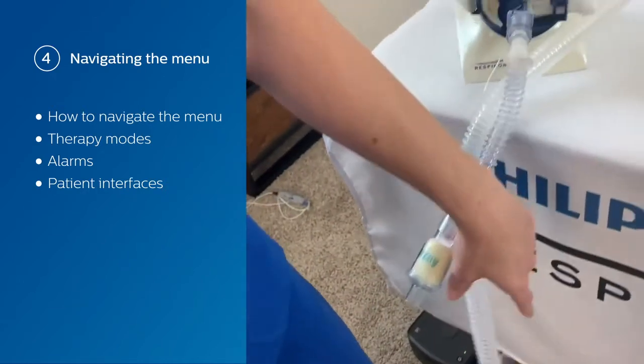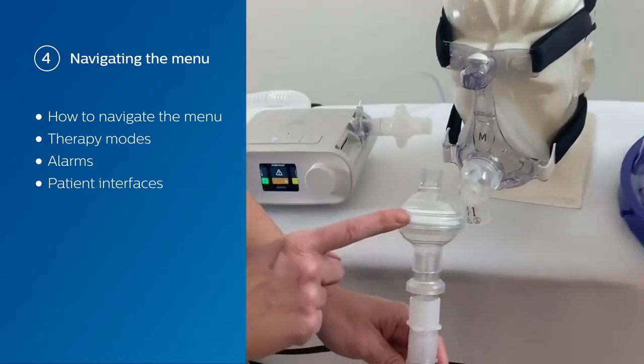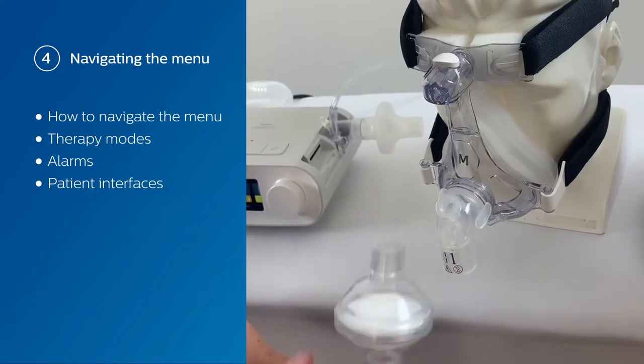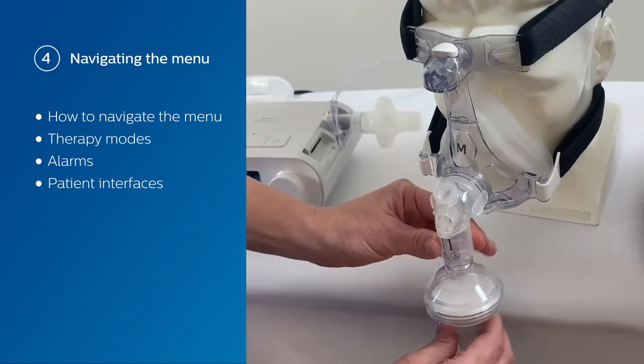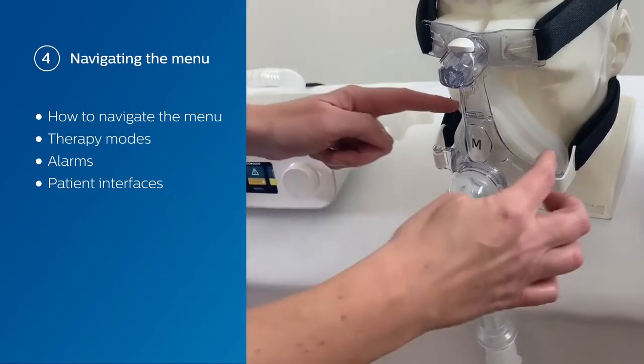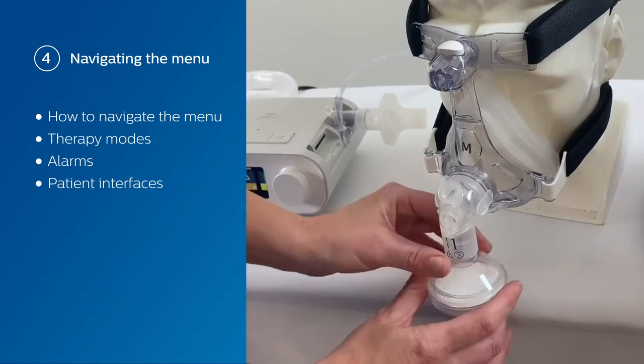If we want to connect to a patient with a non-vented mask, you can use the same circuit with a bacterial viral filter, an exhalation port, and your tubing — we connect right here. Even when using a non-vented mask, we want to make sure that there are no leaks around the mask and that the majority of the air is filtered through the filter.